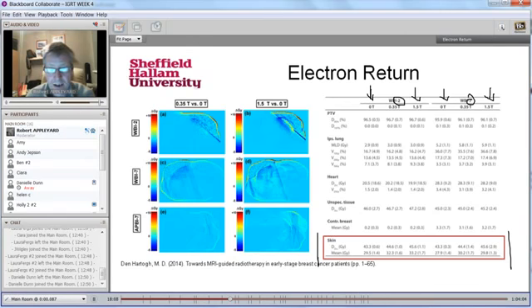This one here is a low field strength MR guided unit, and this one would represent something like the ViewRay system, which I'll talk about in a bit. On this side we have a higher field strength, 1.5 Tesla, typical of what we'd see for many diagnostic MR scanners, and this is consistent with the MR LINACs that have been developed by Elekta and Philips.